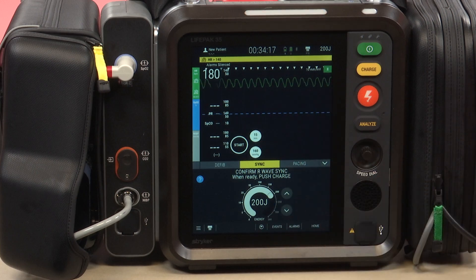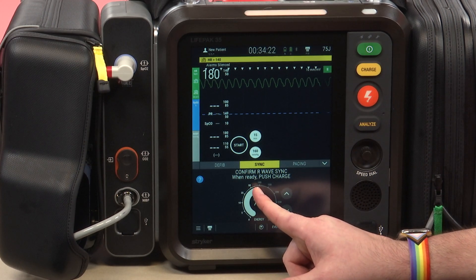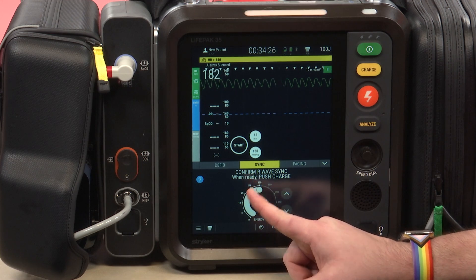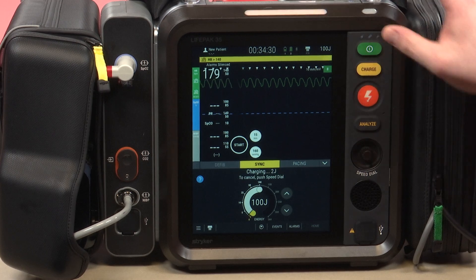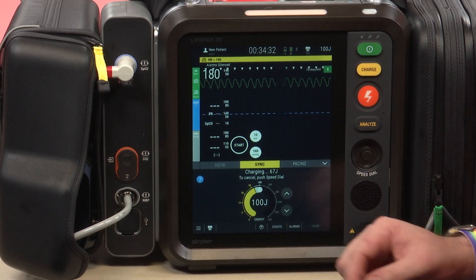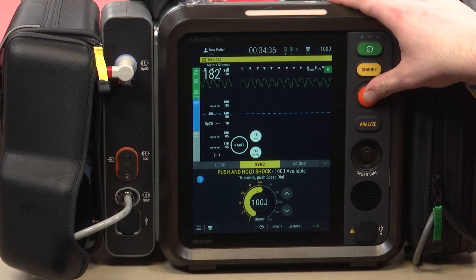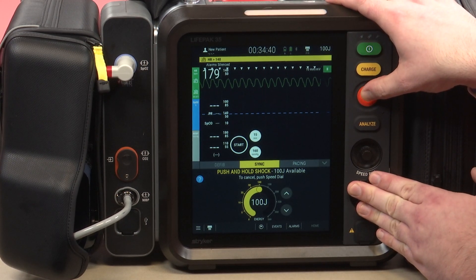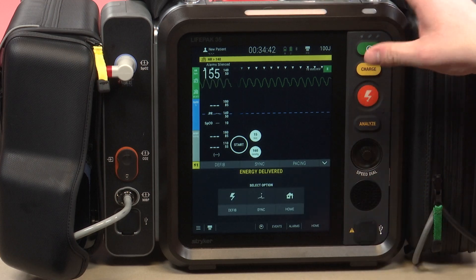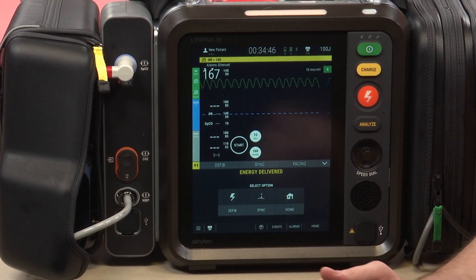Let's say I have this patient here in VTAC with a pulse who is hemodynamically unstable. I'm going to adjust it to 100 joules and go ahead and click charge. It will charge up to 100. Remember that you have to hold the shock button because it's delivering the energy at the exact time of the R wave — hence why it is synchronized.